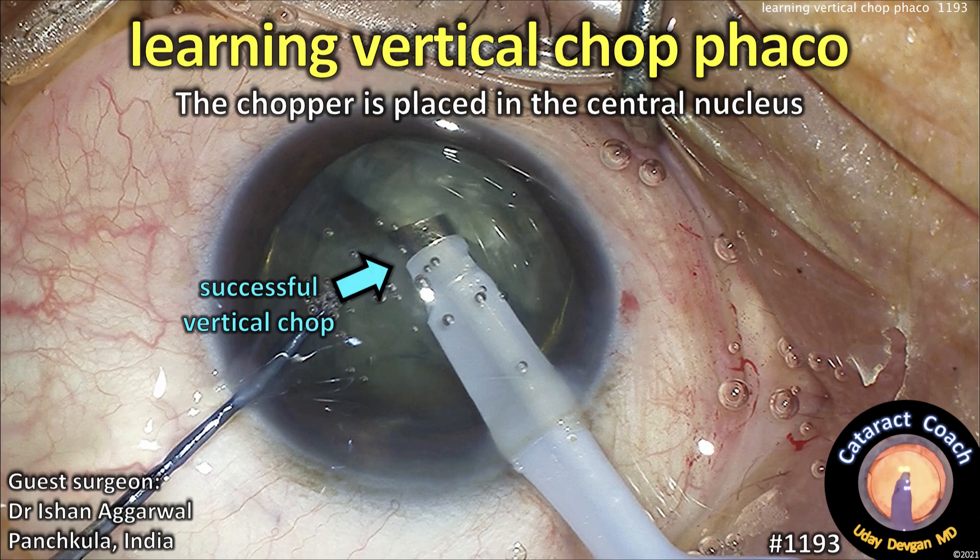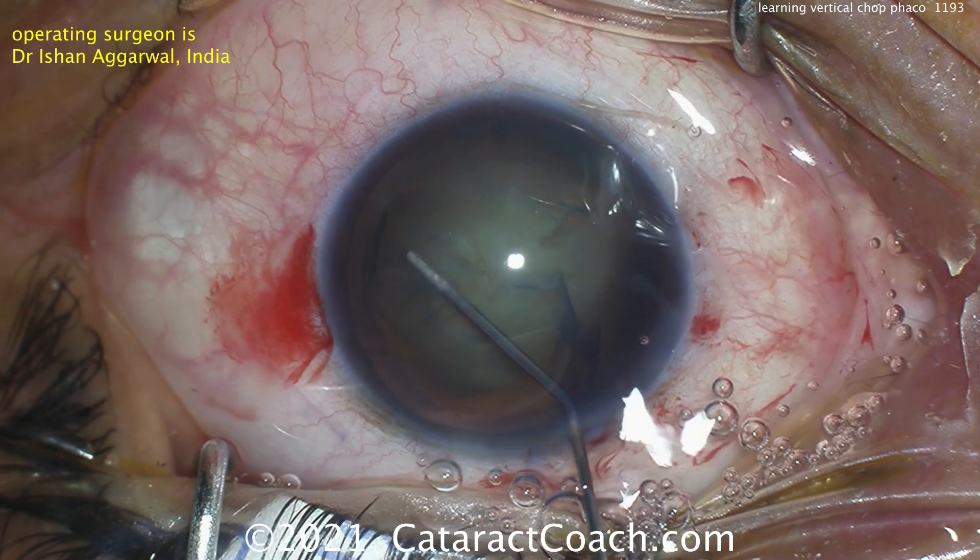CataractCoach.com, Learning Vertical Chop FACO. The chopper is placed in the central nucleus. Our guest surgeon, Dr. Ishan Agarwal from India.